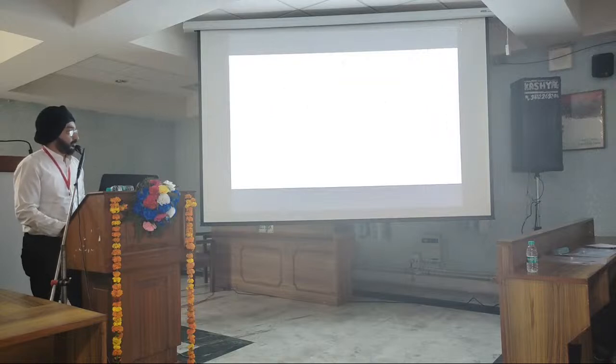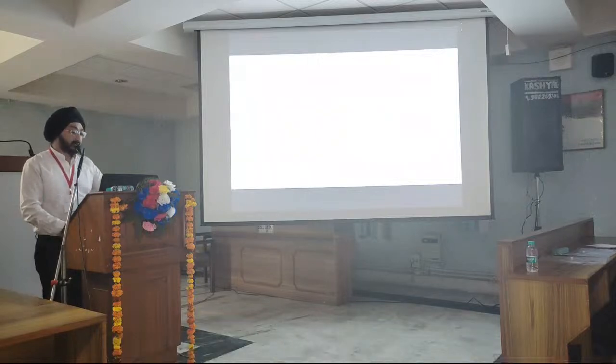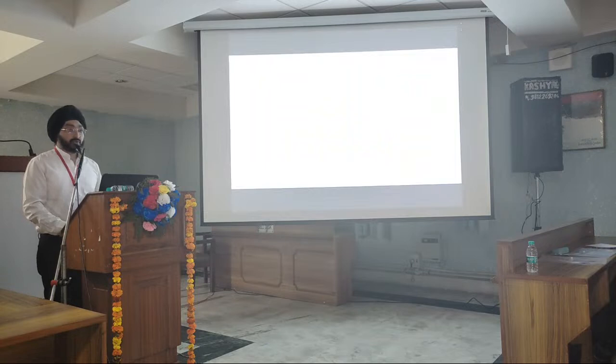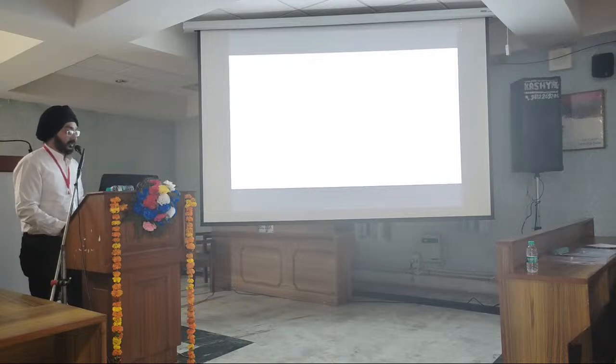So initially the appropriate use criteria were given for PSMA PET in prostate cancer, and it was considered an appropriate imaging modality in newly diagnosed unfavorable intermediate risk, high risk, or very high risk prostate cancer cases. So you have a T2b or higher lesion, PSA of more than 10, and a Gleason score of 4+3. In those cases, it's a good modality for staging. Similarly, it's appropriate to use PSMA PET for detecting recurrence after radical prostatectomy or radiation therapy.